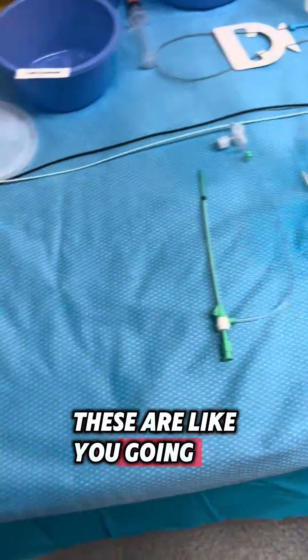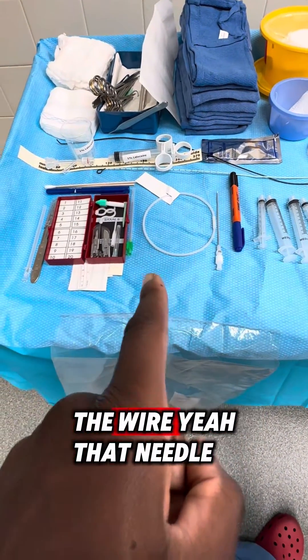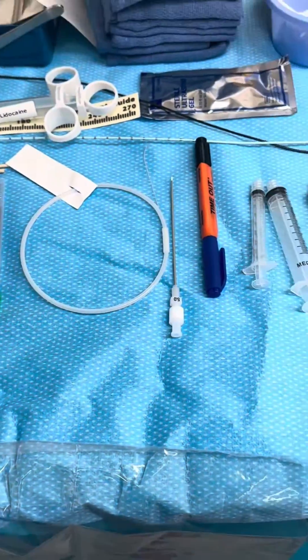These are what you're going with first — the microneedle. Yeah, the micropuncture. You put the wire inside the catheter — that needle right there. And then you upsize to a five French.